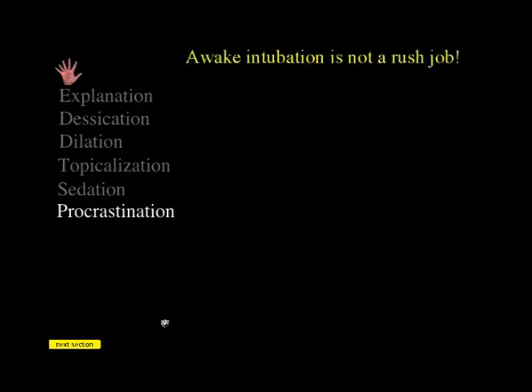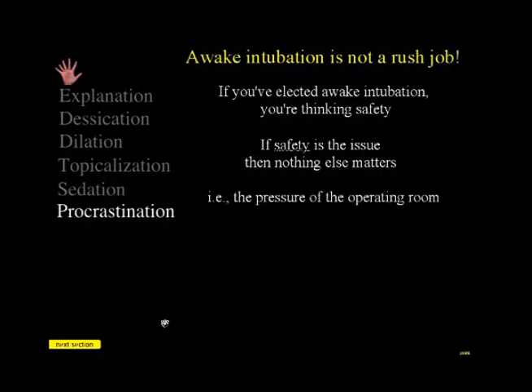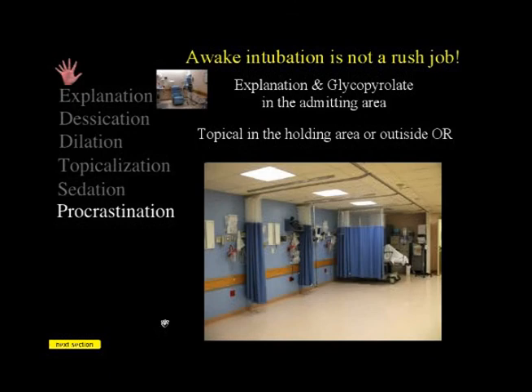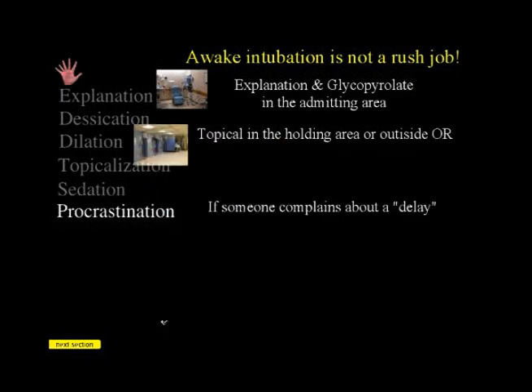Procrastination. Awake intubation is not a rush job. If you decide to do an awake intubation, you decided because of safety. If safety is the issue, then nothing else matters, for example, the pressure of the operating room. Start preparation outside of the operating room. I call this the holding area before. This is actually the admitting area. I do my explanation in the admitting area. I'll do my dilatation in the admitting area, my glycopyrrolate in the admitting area. Topical anesthesia, I'll do in the holding area or directly outside the operating room. If someone complains that you're delaying the case, you've already gotten started. You're already doing your preparation.